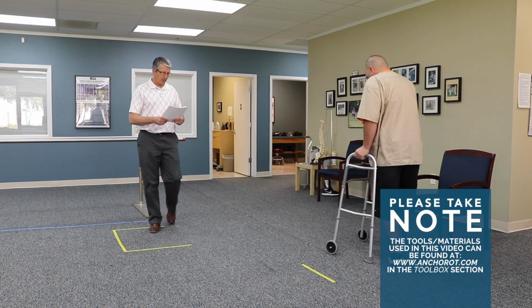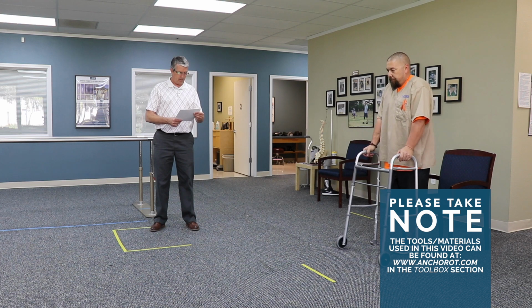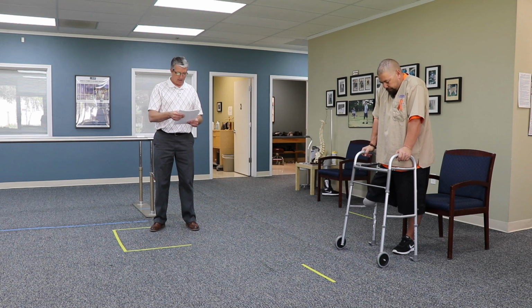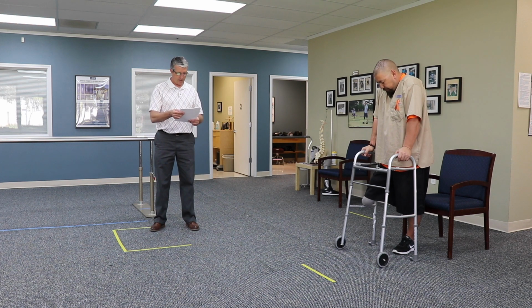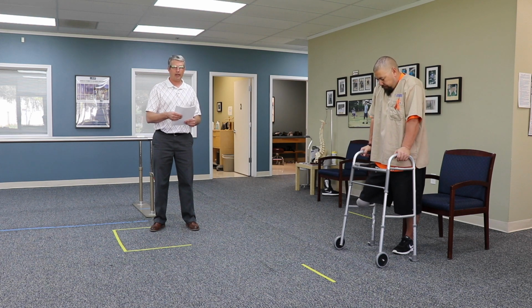Okay, so Jay had demonstrated that very well. On that, I'd give him initiation of gait. He doesn't hesitate. He gets a 1. His step length and height, he cleared his foot. He wasn't circumducting. He had a step length of equal distance. On his sound side, he didn't have his prosthesis on, so you can't comment on that side. So he has a 1. And foot clearance, he has a 1. Step continuity, he has a 1. It was very symmetrical. And his turning ability, even with the walker, he's able to go down and do a 3-point turn and come back.